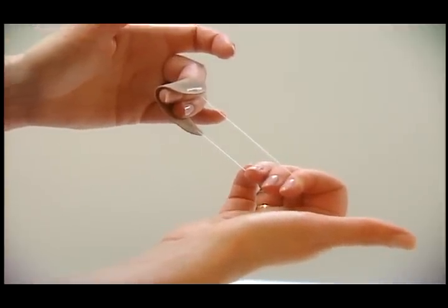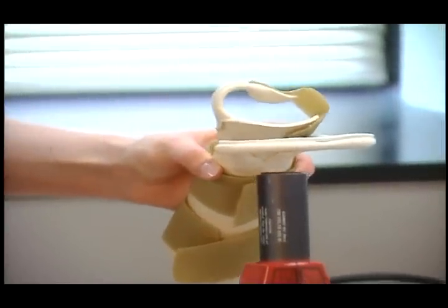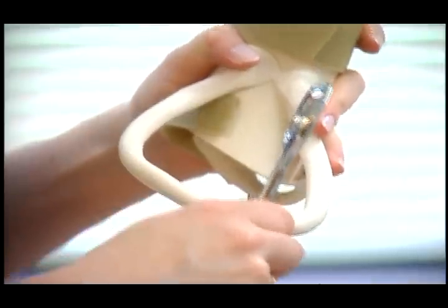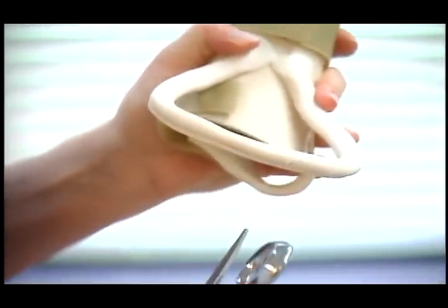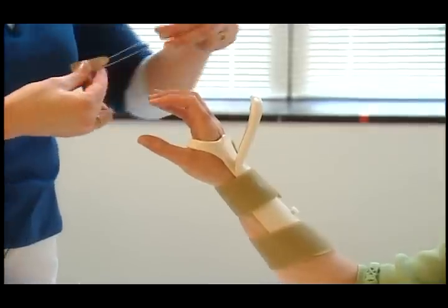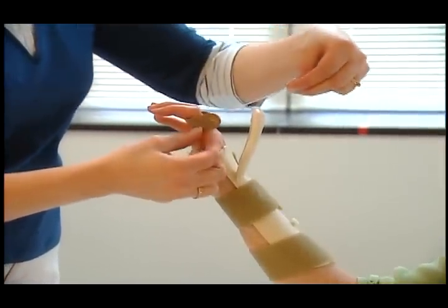The top surface of the outrigger is heated and a groove is made in the splint material that lines up with each finger to be mobilized. This will guide the monofilament as it moves over the outrigger, ensuring the correct direction of pull. The monofilament attaches to a finger sling to provide the appropriate tension to the joint being mobilized.